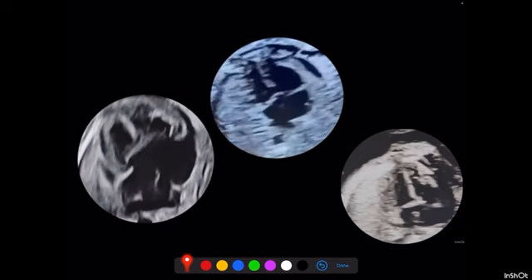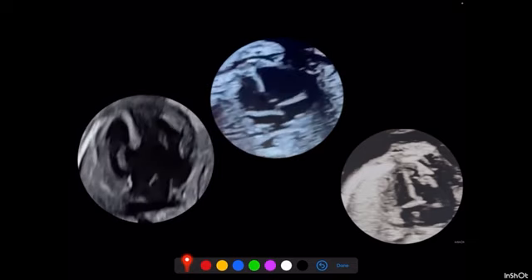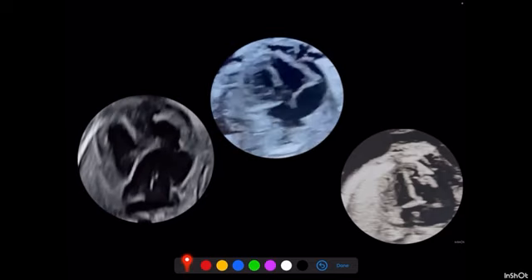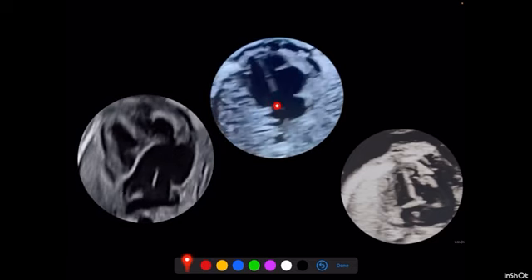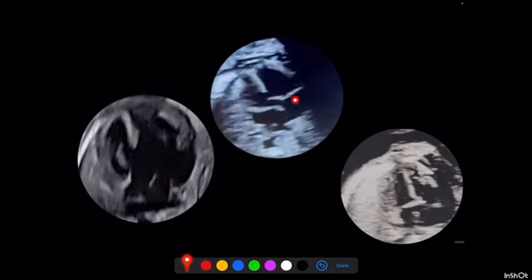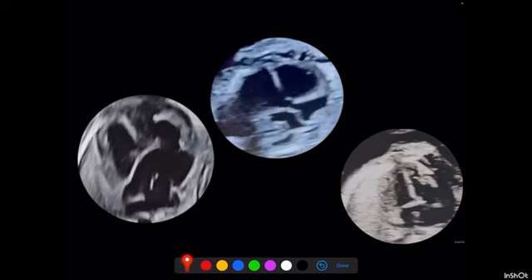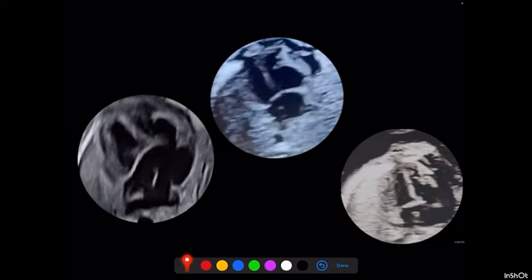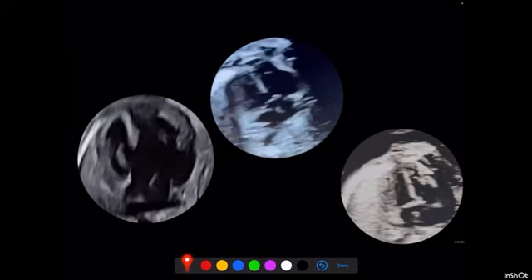In this, you can clearly appreciate there are two inlets, whereas there is only one valve but two inlets. You can see one large VSD here. There is an ASD here, and you can see the ASD clearly. Two inlets, I repeat again: linear insertion of the valve, two inlets, VSD. And I'll show you the ASD. This is the ASD.